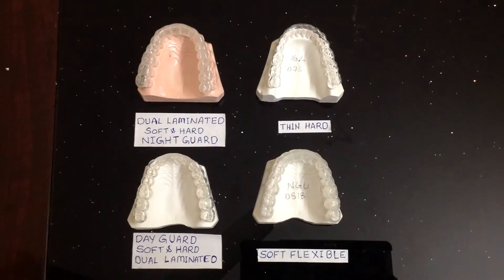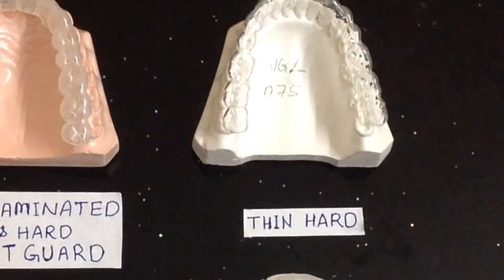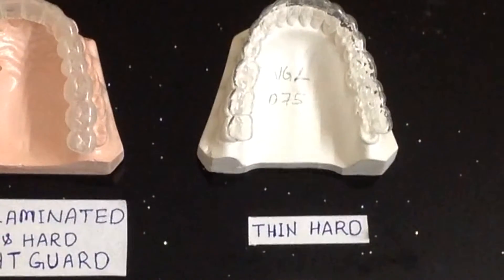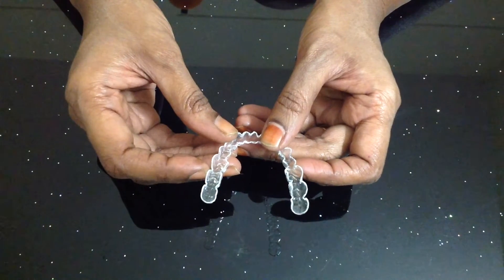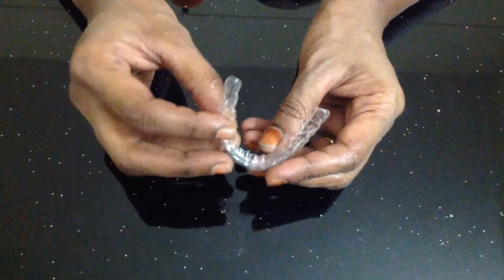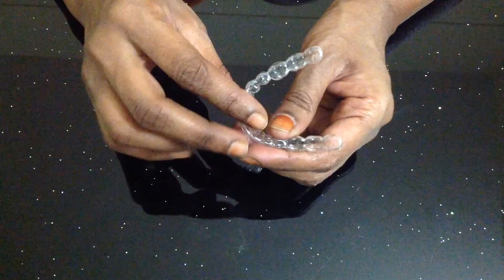We make here four different kinds of mouthguards. The first one is the single layer thin hard nightguard. This guard contains 1–2 mm of hard dense protective material. Indication: this is used for night clenching where a less bulky solution is required.